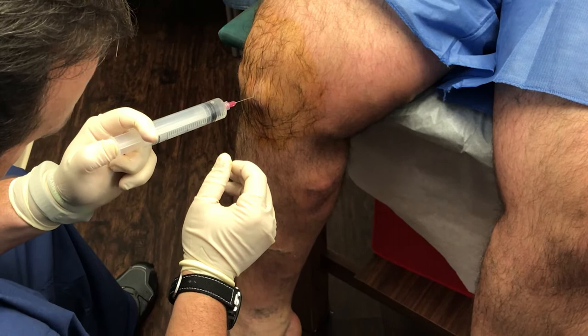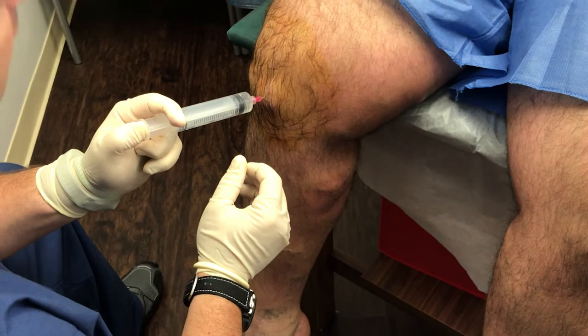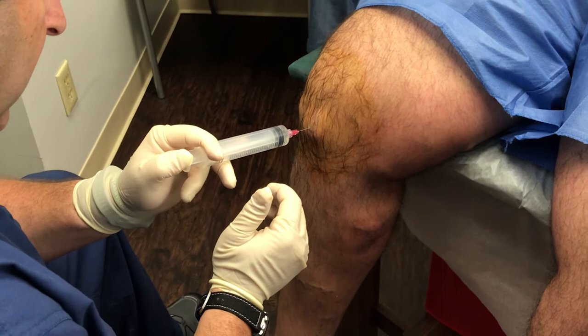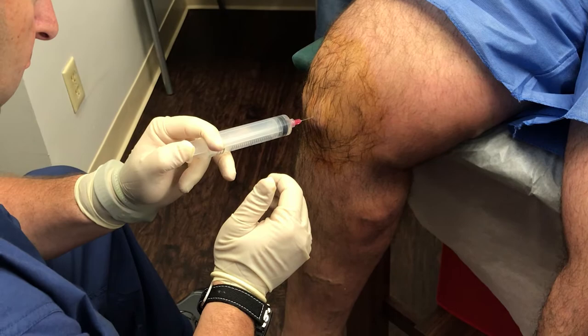That would be decided — I would administer the Monovisc, we can just do it through the scope. So once I have the camera in there, if we don't see a tear or any significant tear, then that's exactly what we'll do. We'll put it right through that so you don't even need to feel another needle.